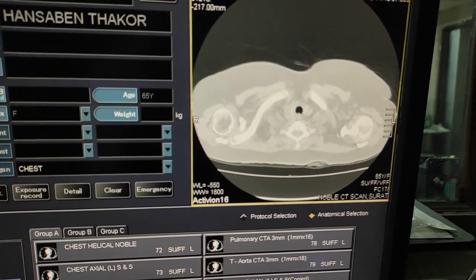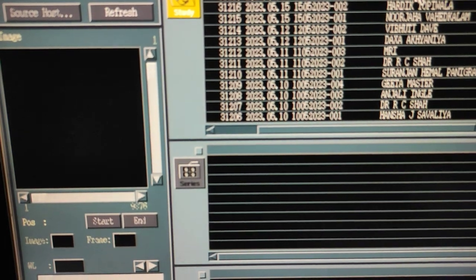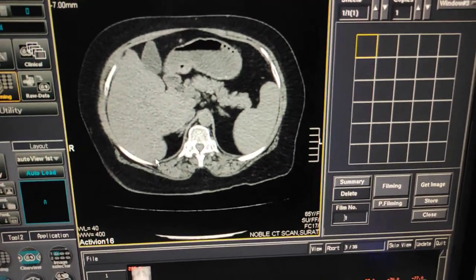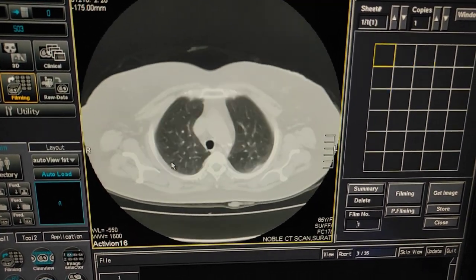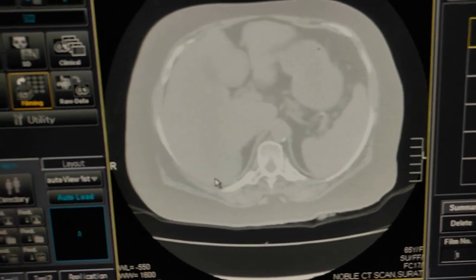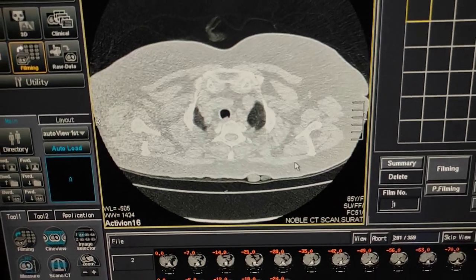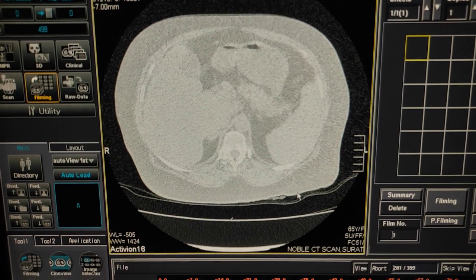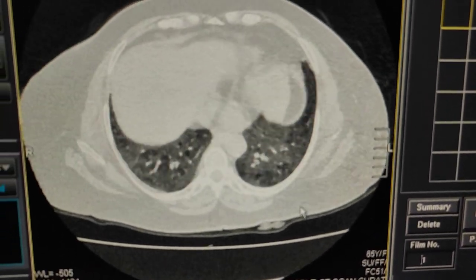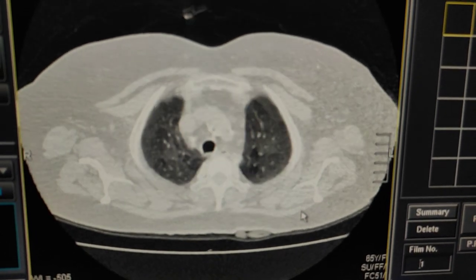Wait until the images load. Go into the patient data filming directory and select the patient. Click on filming, select these images — this is the raw data. Now I will do a recon for these images and check whether the images are okay and whether the patient held their breath properly. Looking at the recon of the HRCT scan, there are no motion artifacts in the lower area — the scan is proper. You can now remove the patient.